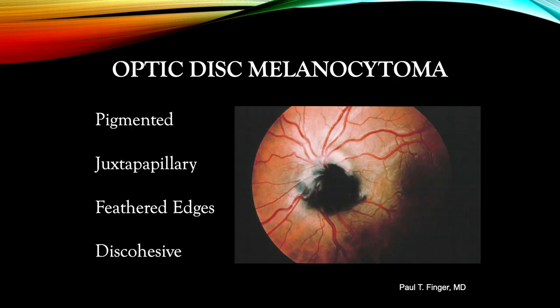Let's move on to another pigmented intraocular tumor: melanocytoma. These tend to be darkly pigmented, juxtapapillary, have feathered edges, and can be quite discohesive with vitreous cells. Though some can be brown, and others can display orange pigment on their surface, and others can undergo malignant transformation, there have been no reports of metastatic disease. Commonly associated with optic disc edema and vitreous seeds, the melanocytoma is a magnocellular nevus — a form of nevus.